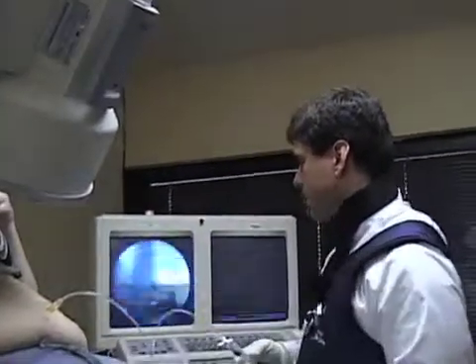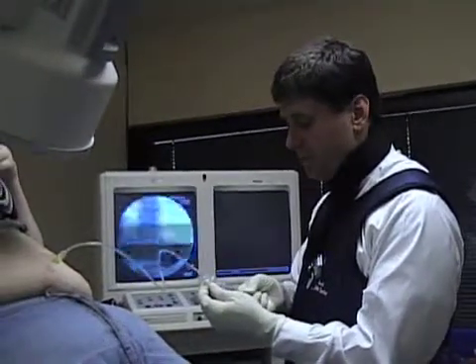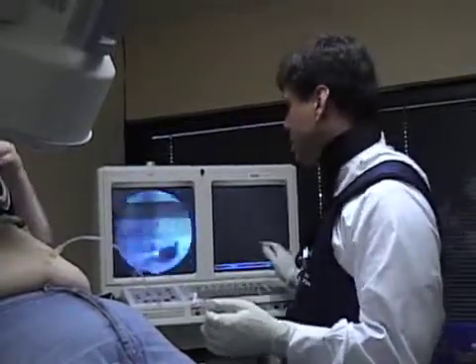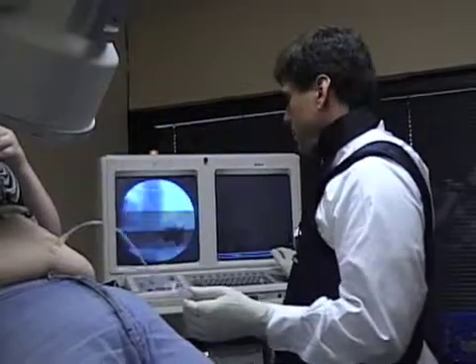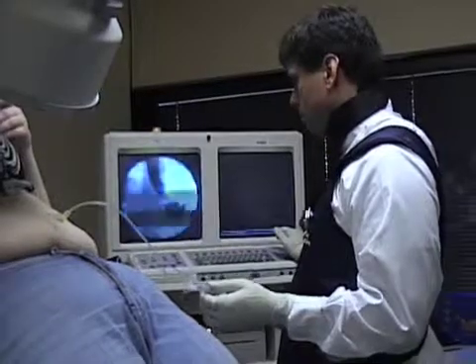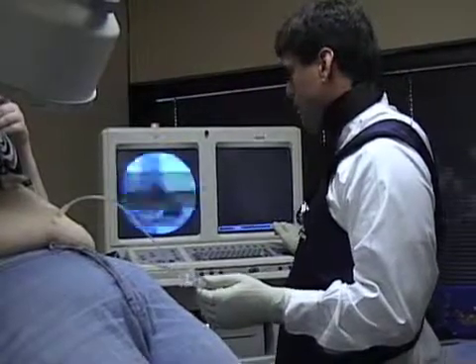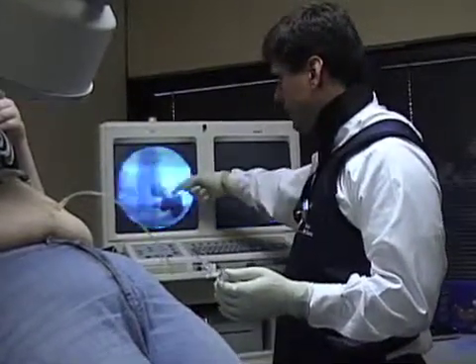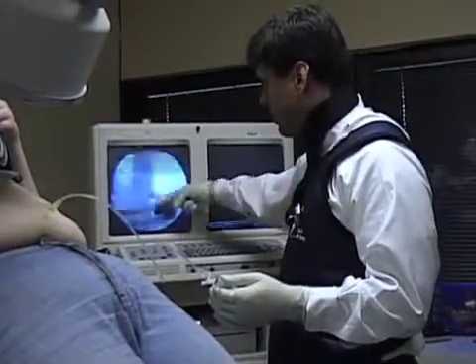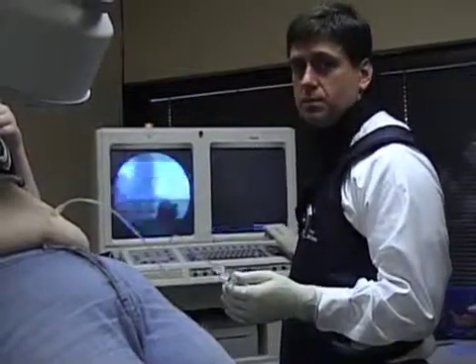This is a very good looking band and a very good looking pouch, but we're going to put in a small amount of fluid — this is a half a cc. We're going to take another swallow, please. I can see that the stomach is spilling, and this is a very, very nice emptying of the pouch. It sits right here, and the band is right here. Very, very smooth. This is a very nice adjustment. We're done.